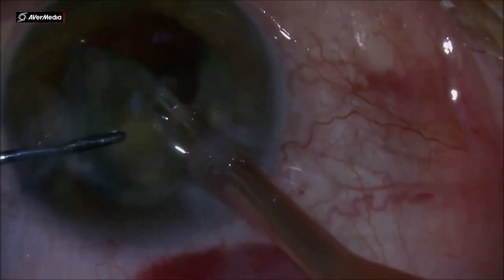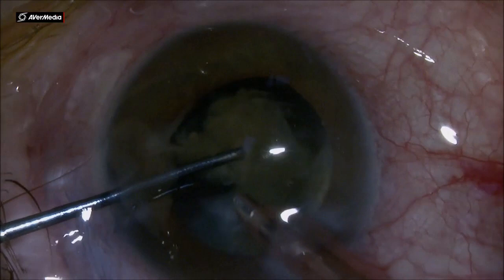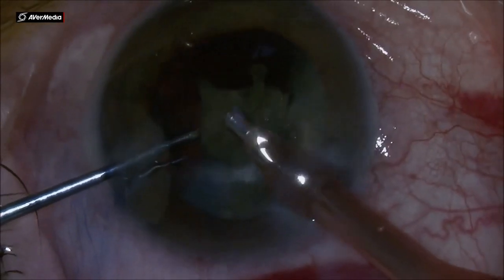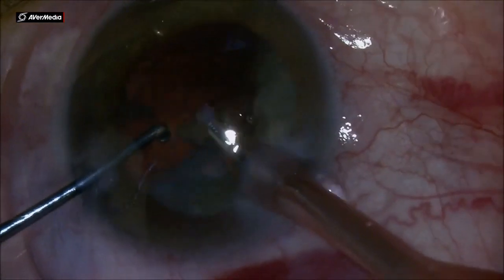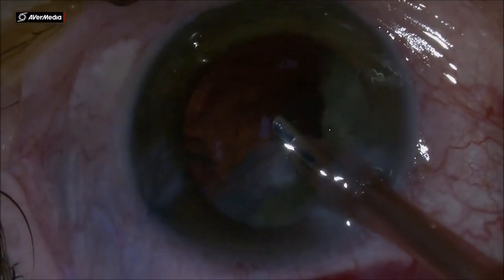This will ensure a clear cornea the next day, and you make sure you don't have a surge into the anterior chamber and bring the posterior capsule very quickly into the phaco probe needle. Having these smaller and smaller pieces, I think it's a good idea to do these cases.